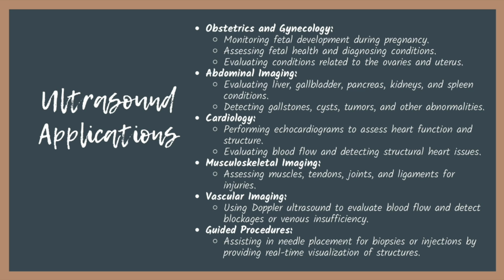There are multiple benefits of ultrasound. Again, it's non-invasive, so there are no incisions or injections required. It's safe. It does not use ionizing radiation, and it provides real-time imaging. So we get live images which allow for dynamic assessments. And again, there are portable options, so they can be done right at the bedside if needed.